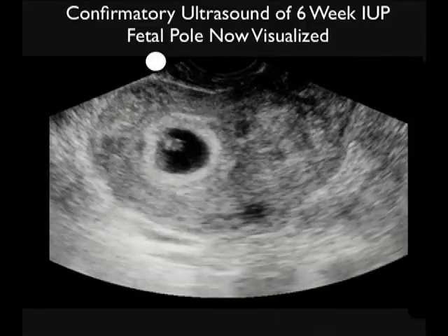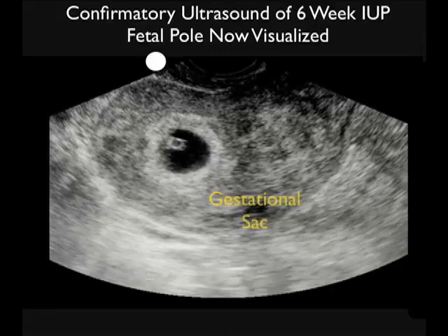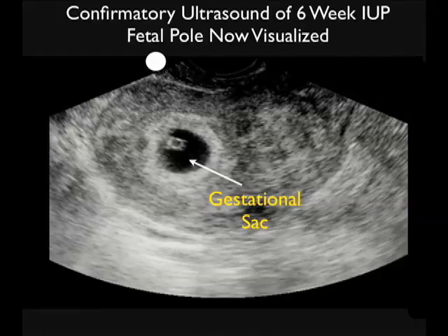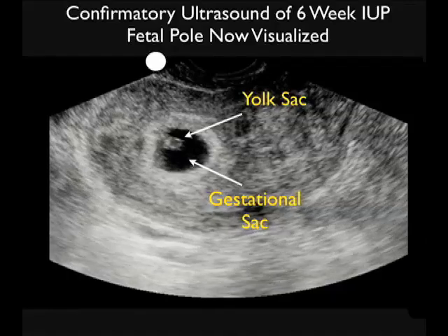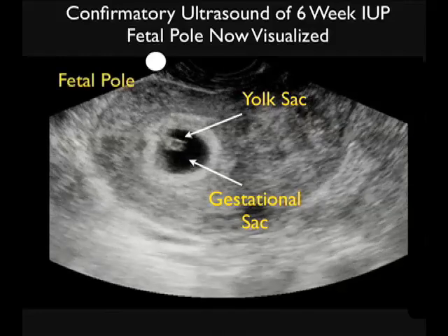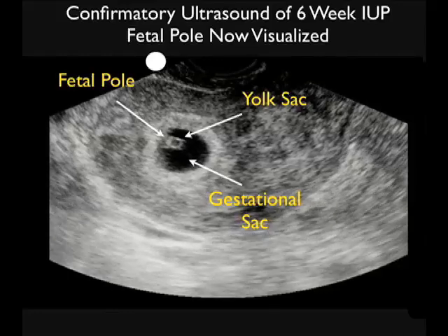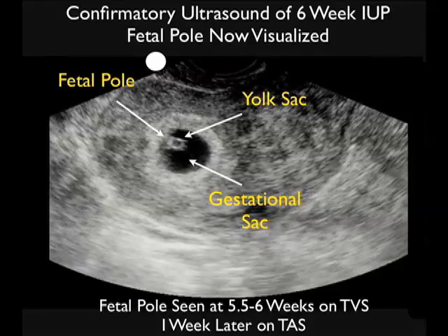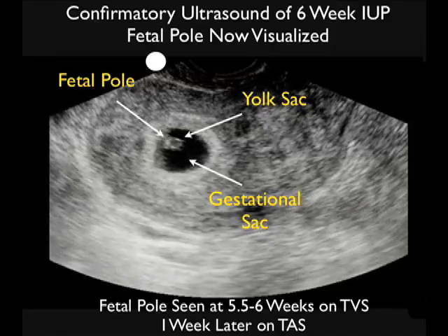Here we see a pregnancy that is a bit further advanced. We have a larger gestational sac — the darker, hypoechoic area within the fundal region of the uterus. Inside we see the positive yolk sac, or cheerio. And just to the left of the yolk sac, we see a tiny fetal pole. Zooming in on that fetal pole, we can make out the flicker of a heartbeat — a definitive intrauterine pregnancy. The fetal pole is seen at about 5.5 to 6 weeks on transvaginal sonography and about a week later on transabdominal sonography.